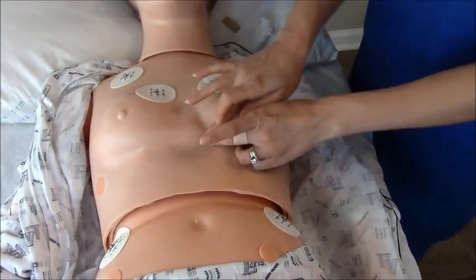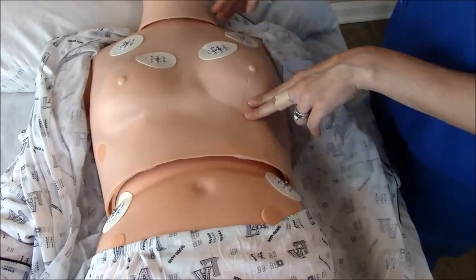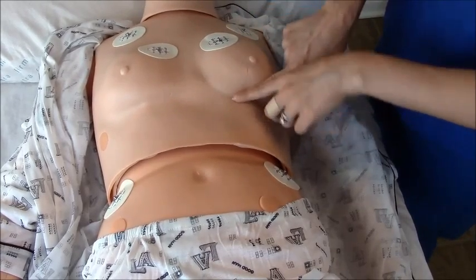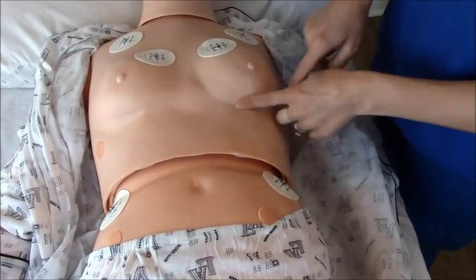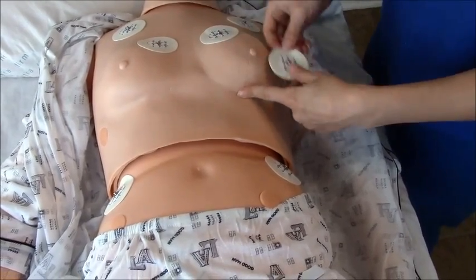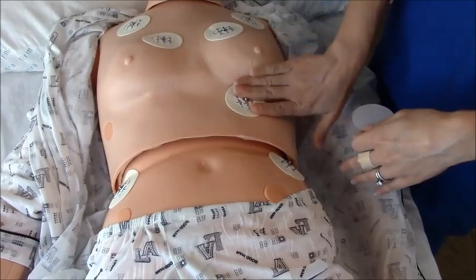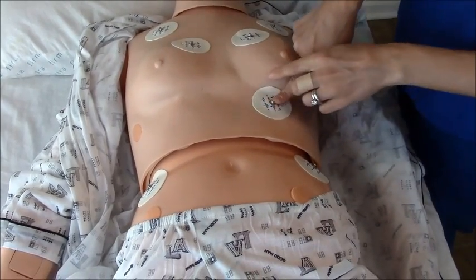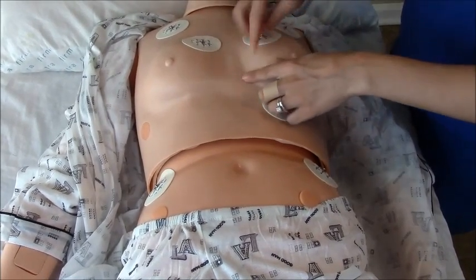We're going to skip to V4 first. For V4, go mid-clavicular at the fifth intercostal space. On women, because they have breasts, you'll need to go a little bit under the breast — you can't place a sticker on breast tissue as it will mess up your EKG. You can always prep all the skin before placing the stickers; you don't have to do it individually. So that's V4. Now go back to V3, which is placed in between V2 and V4 — just about right there.